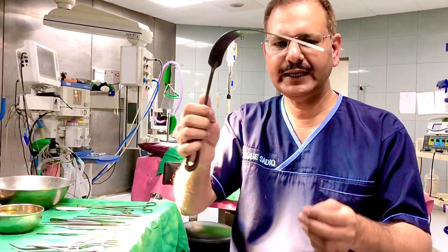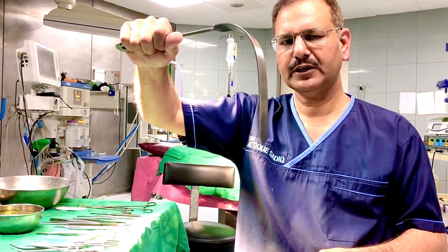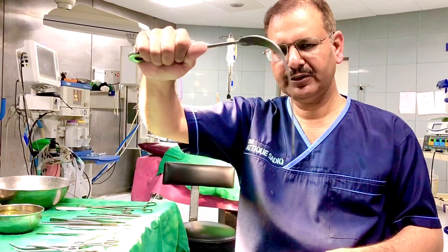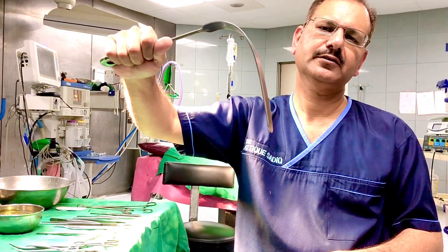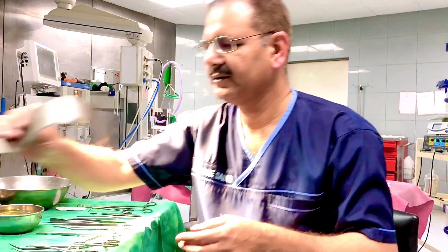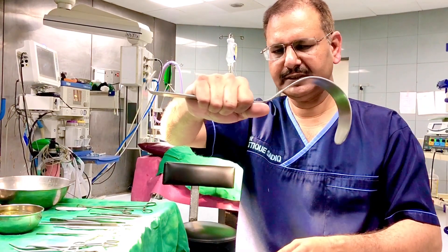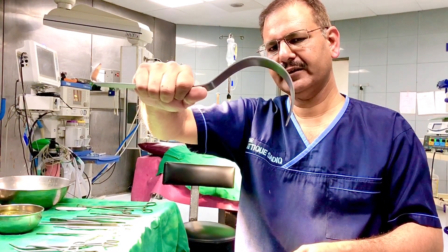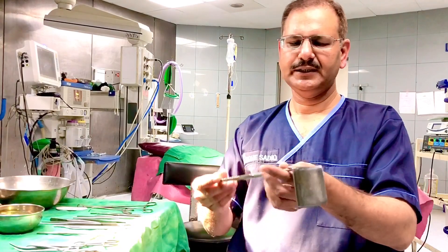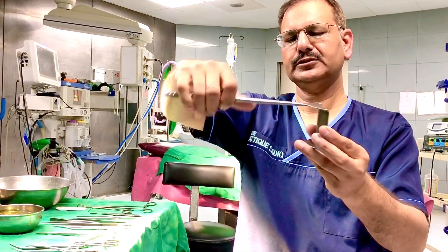This is a Langenbeck retractor, used for retraction of soft tissues and delicate structures in depth — for example, in cholecystectomy for retraction of the stomach. This is a Deaver's retractor, also used to retract delicate tissues like the gut and liver.